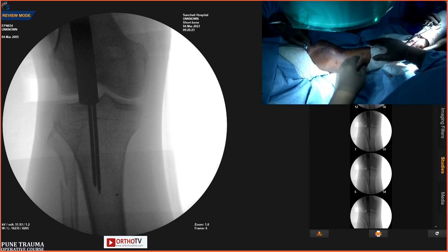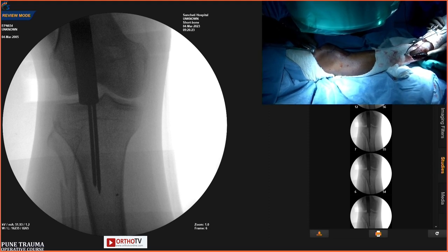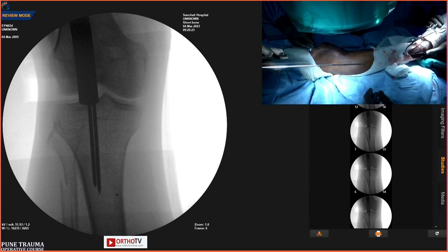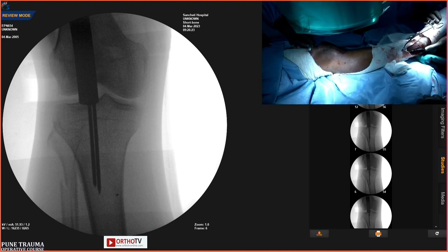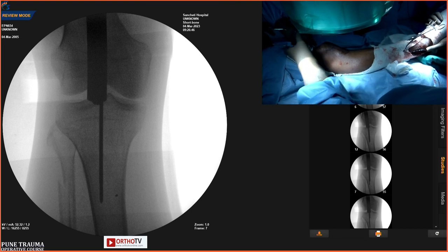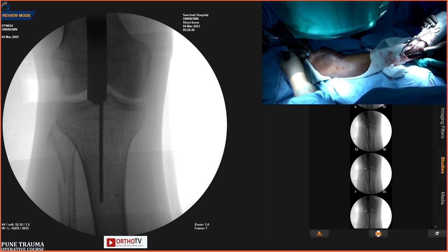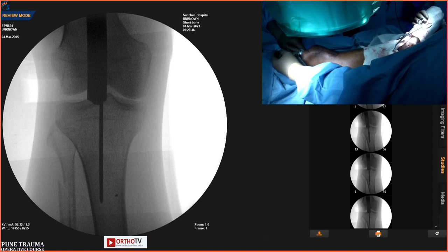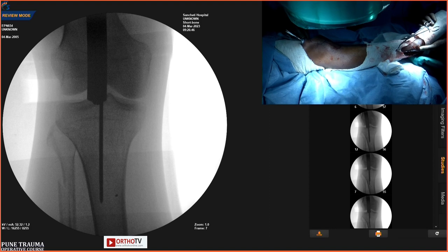This is the proximal pin. Now we have to ream it. Small one first. So generally what I do is sequential reaming for proximal, also in a proximal fracture. Because if you pass a large 13 or 14 mm reamer for the first time, probably you might land into fracture propagation. So it is always better to do with the smaller one first and then large.